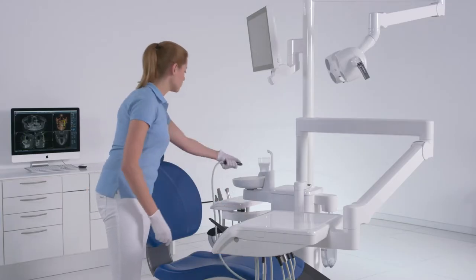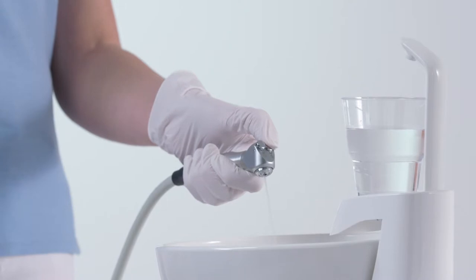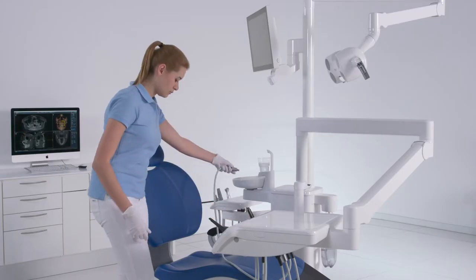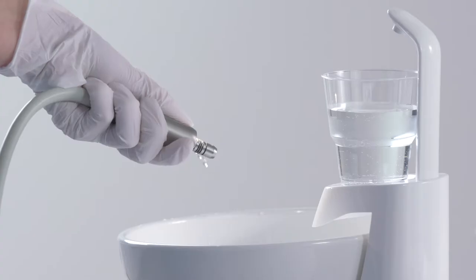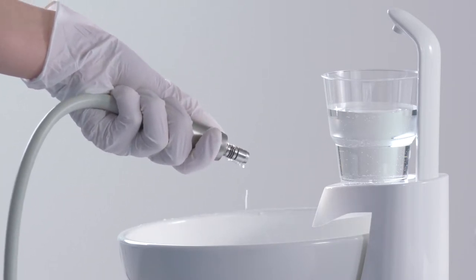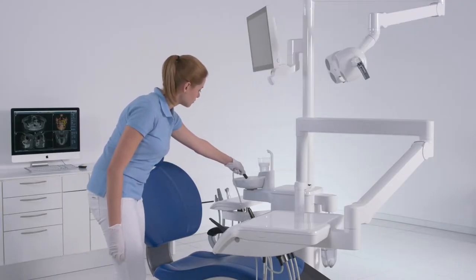Hold the syringe of the dentist and assistant element over the cuspidor and press the water key for at least 15 seconds. Remove a single instrument and hold it over the cuspidor. Briefly press the foot control. The removed instrument will be flushed with water for about 15 seconds. Flushing stops automatically. Repeat the procedure for all other instruments.